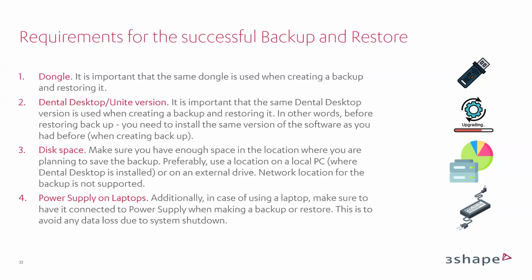Then we have the power supply on laptops. When we are proceeding with backup, we always ask our customers to plug it into the electricity, because we need to do it to avoid any data loss due to a system shutdown. So laptop PCs should be connected to the sockets and electricity.